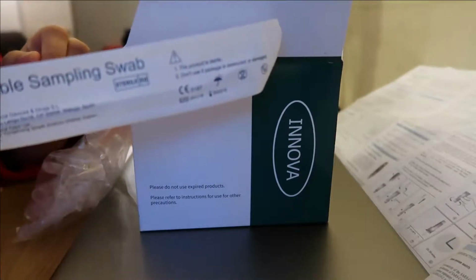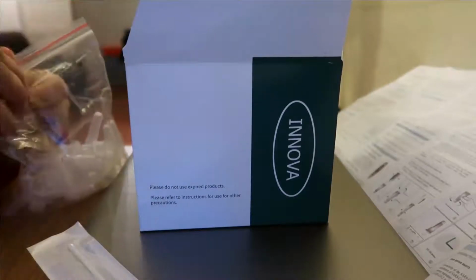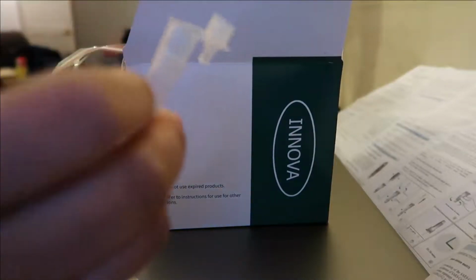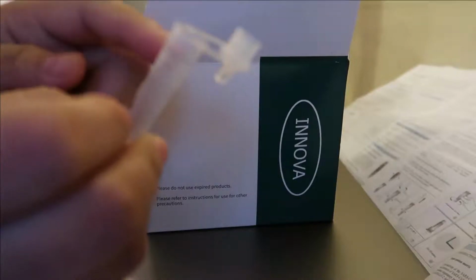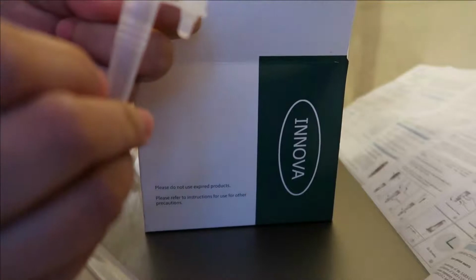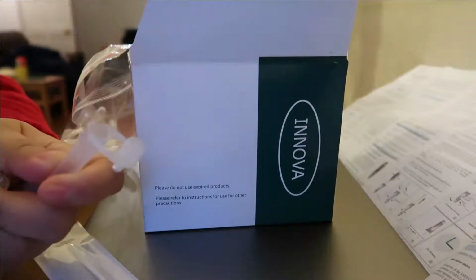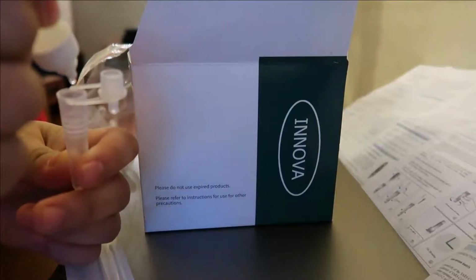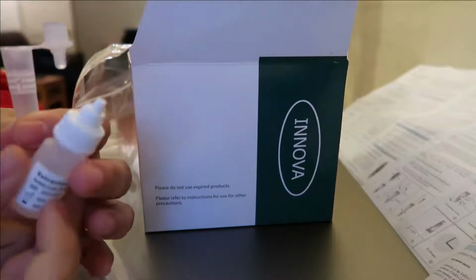Okay, so using the swab, what I normally do is I prepare my extraction tube and the things here first before I do the swab, because it's easier that way. So here is the extraction tube, and you see the cover, that's the one you need to put on there. You don't touch the edge, just touch the handle. Okay, this is the extraction solution. The instruction is to put 6 drops into the extraction tube. Let's see, 1, 2, 3, 4, 5, 6. So that's it.